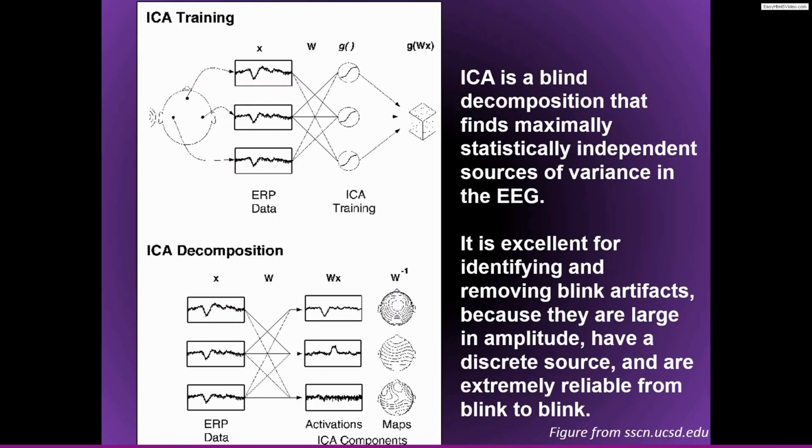So taking this idea of identifying speakers amongst all these other sources of auditory signals, the idea of ICA for EEG data is that there are multiple independent sources of activity in the brain. There's brain activity, there's eye movement, so there are other sources that contribute to the signal in EEG that are not even coming from the brain, muscle artifacts, all sorts of different visual dynamics, motor dynamics, everything in between.